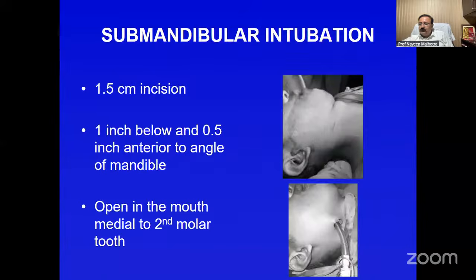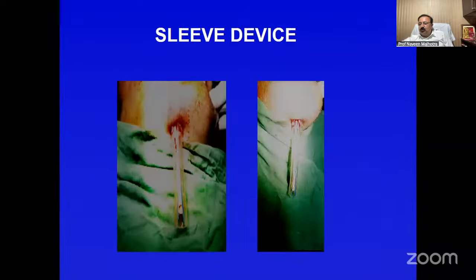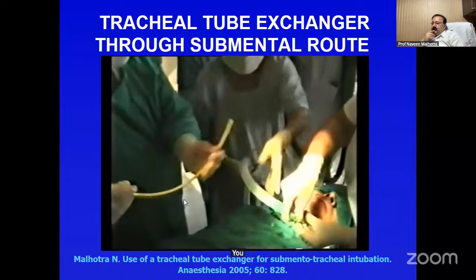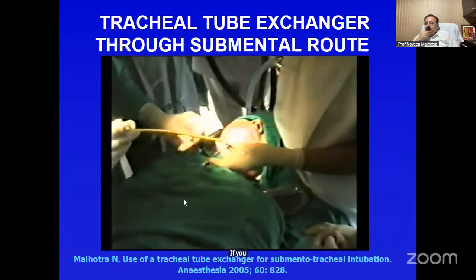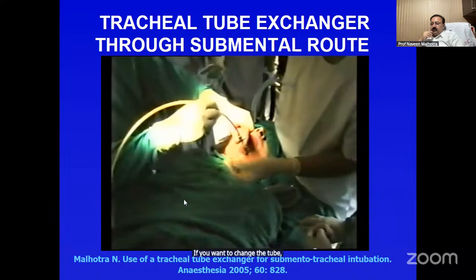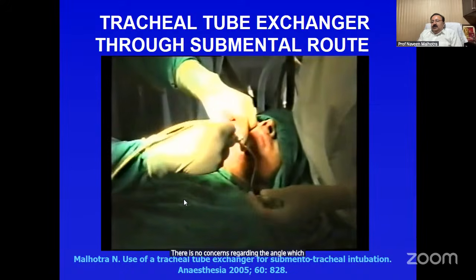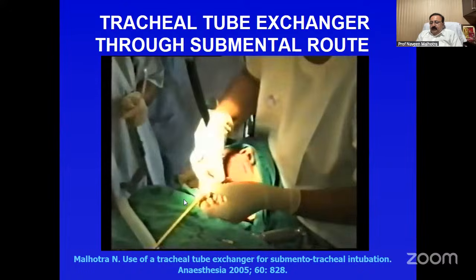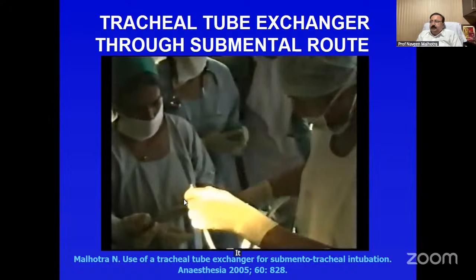This was about the sleeve device. If you want to use a tracheal tube exchanger, you can easily use it. If you want to change the tube, absolutely no issues. There are no concerns regarding the angle which the tracheal tube exchanger has to negotiate. It can be done with a lubricated one. It is easily done.